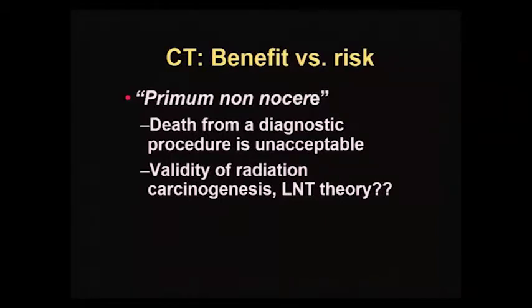So this brings me to one of the take-home messages, the benefits versus the risk of CT scanning. First, do no harm. Death from a diagnostic procedure is never acceptable, and that is very clear when it comes to this cardiac death from this Williams syndrome. But then what about the validity of the radiation carcinogenesis and the linear no threshold theory? We had a lot of arguments in this meeting, pro and con, very strong opinions were being voiced.